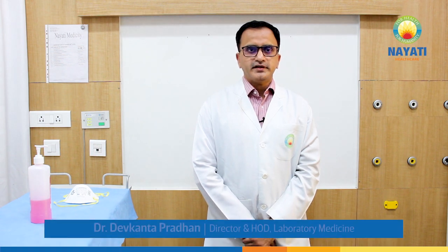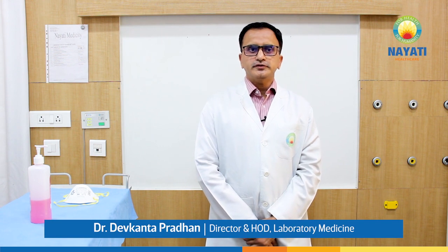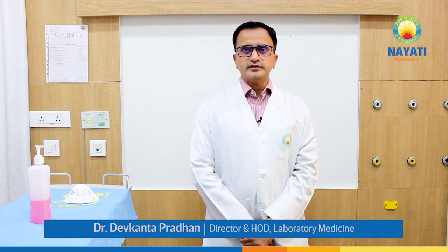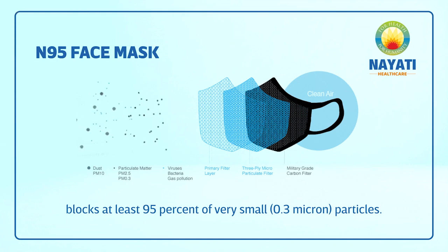I am Dr. Devkan Pradhan. I am a microbiologist by profession. Today we will demonstrate how to wear an N95 mask and how to remove it. N95 is a special type of mask which filters out 95% of particles which are more than 0.3 micron in size.